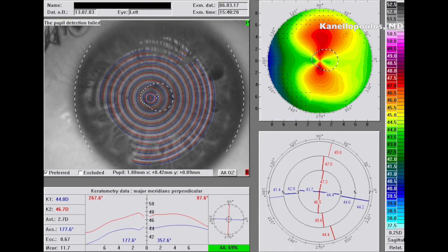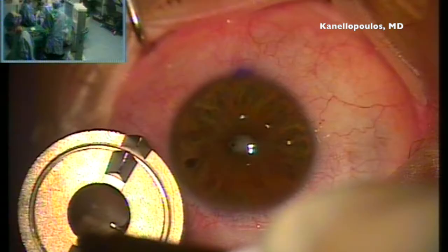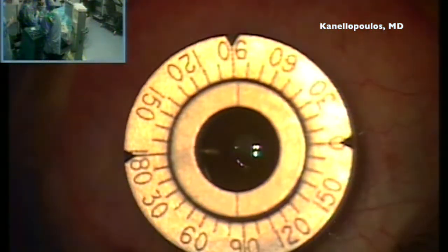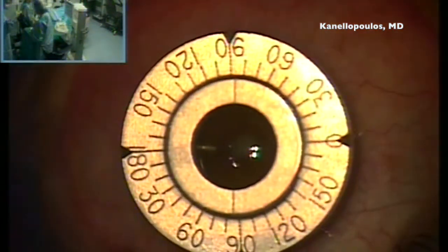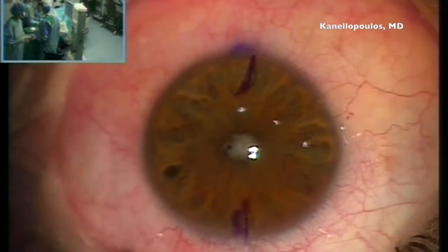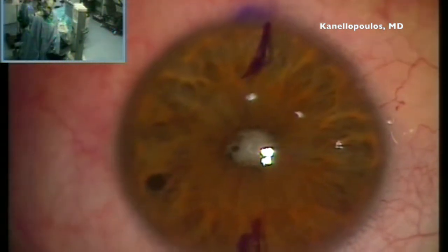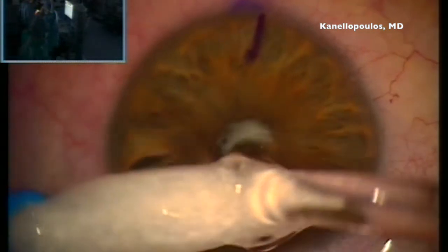Inadvertently, he has very significant astigmatism, 2.7 diopters. So you know what I'm thinking. Since 90% of our cataract cases involve toric intraocular lenses, we'll employ this tool for this young gentleman in order to optimize his visual acuity. Our classic 6 o'clock mark and the implantation axis come from the toric Acrosoft calculator that we saw earlier, and we'll rinse, and then first try to resolve the phimosis.